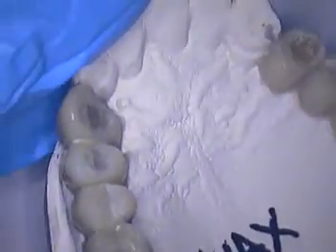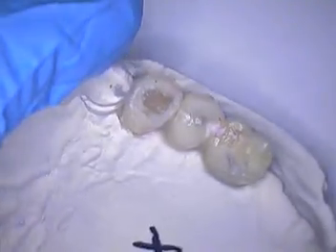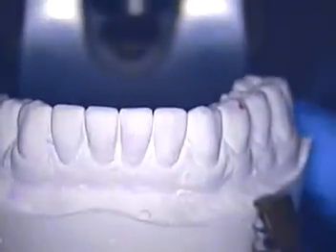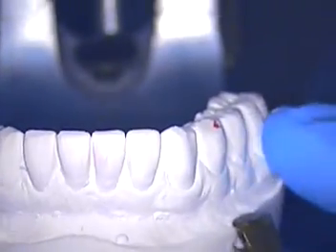I'm going to bring out now the wax up. I've already mounted this case, which was edentulous in the posterior. I used ion crowns — plastic hollow crowns that you can grind and further hollow the occlusion so that you can bring the cusp tips down to where they align better in the posterior. Frank's case has somewhat of a malocclusion and the lower dentition are all crown teeth. It would have been nice to redo the lower, but it might have included root canal therapy on the left side, so we avoided that and went with the occlusion that we have.